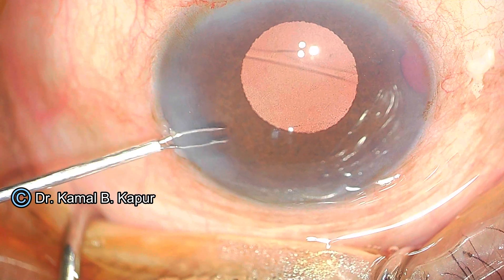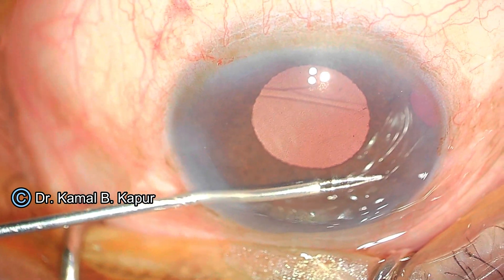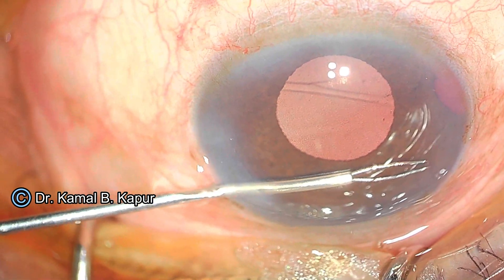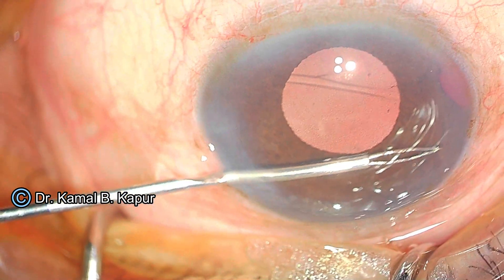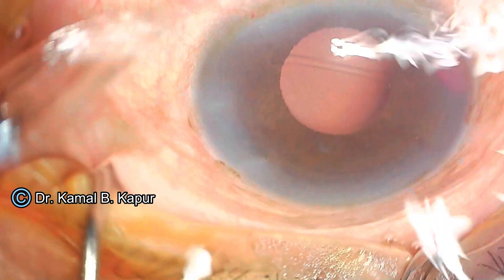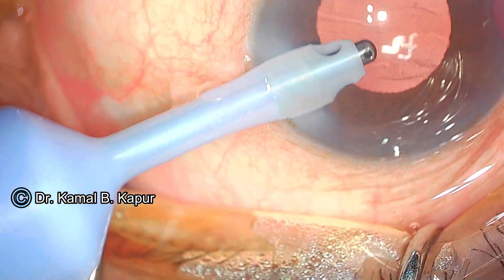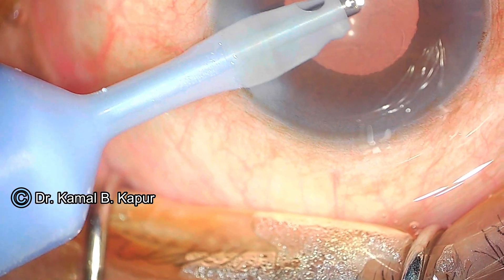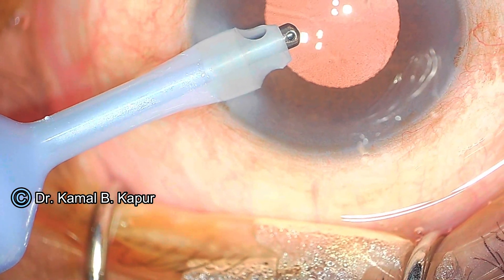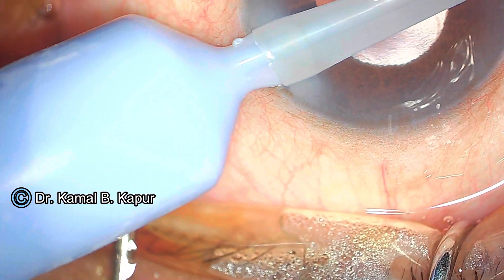I will now go in and remove the tissue scraped off by the KDB blade, peeling out the trabecular meshwork tissue — you can see it is totally scraped off. Some tissue is pulled out, with slight ooze in the anterior chamber, but by now the bleeding has stopped after waiting two to three minutes with viscoelastic inside. Use slight aspiration, but avoid going very near the angle where you performed the procedure, as you could dislodge a small clot and cause re-bleeding.